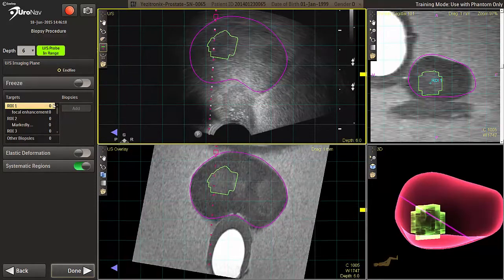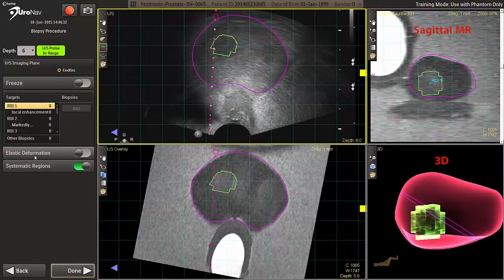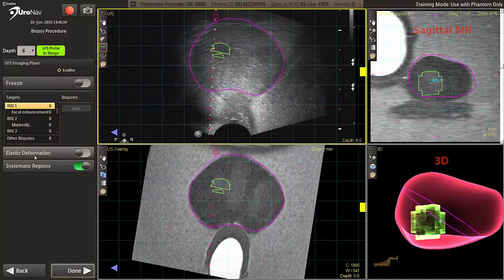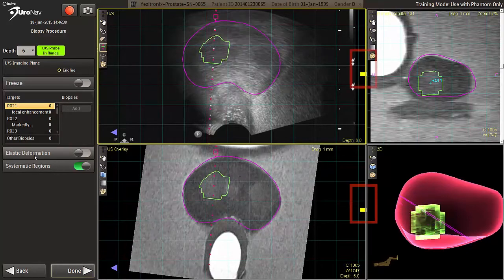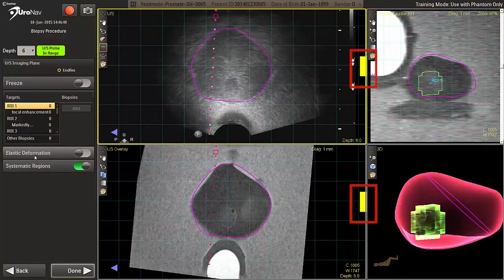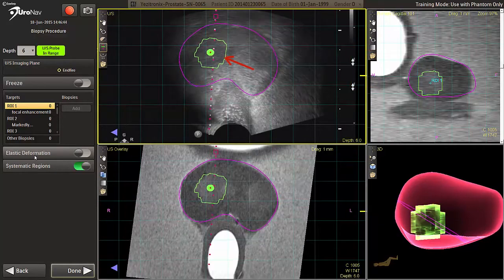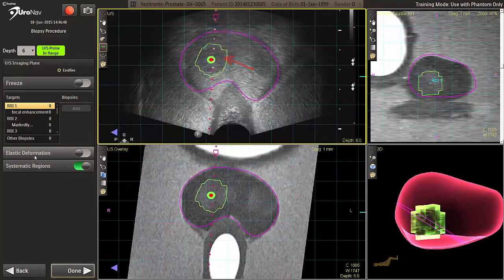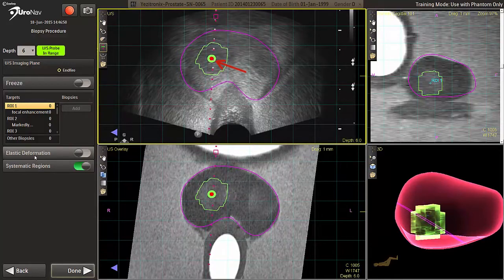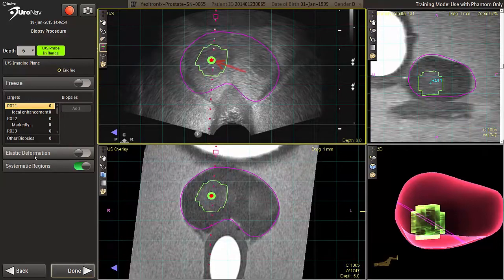The selected target in the list influences 2 images on the right of the screen, showing the target location in a static sagittal MR view above and a 3D view that actively reveals movements of the probe array. The 3D view may be used in conjunction with the color-coded guidance bars that direct users to the specified target location. Green, outlined targets come into view as the colored guidance bar is diminished. A centroid with a red dot represents the center of the target.